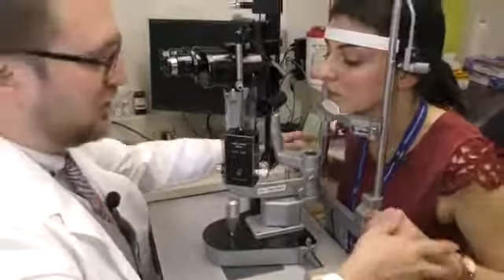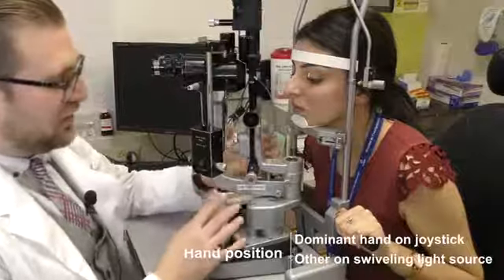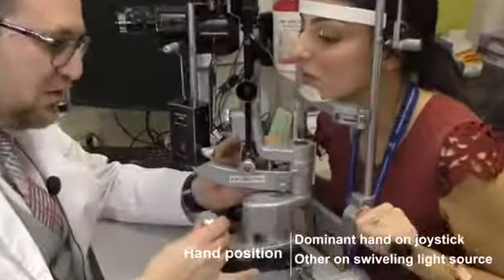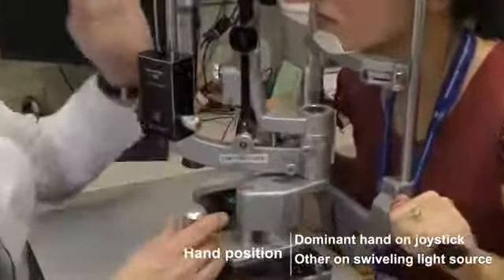Okay, so that's very important when you want to raise or lower the beam when you're looking at the cornea, for example, here. The next knob I want you to look at is the other knob that you're going to hold in your hand on the left side. What I tend to do is use my dominant hand to hold the joystick, and my left hand rotates the light like this and also holds the knob on the bottom. This is the most natural position, and this is the only position you need to have during your exam.